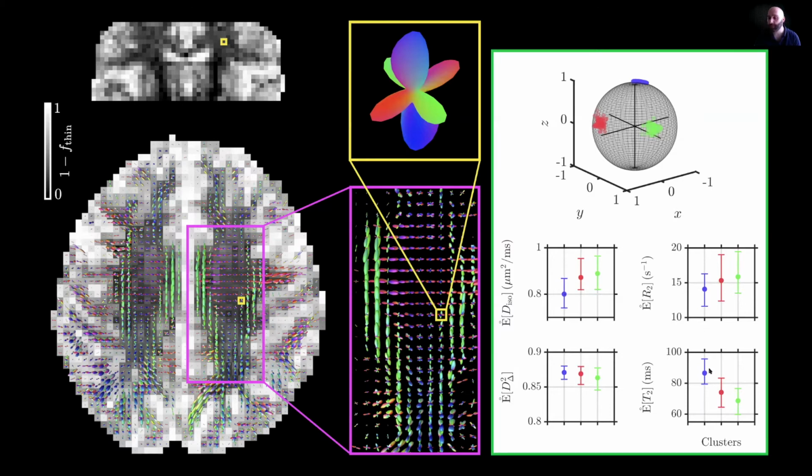And then you can use statistical testing to assess whether or not two fibers are very distinctively different. And in that case, you can see that the T2 here is much larger. Well, it seems much larger in the corticospinal tract, the blue one, compared to the other ones, which we saw already before in multiple papers. So I can test that. Statistically, it makes sense. They are different.